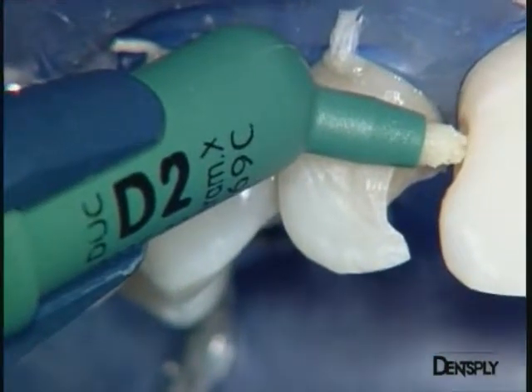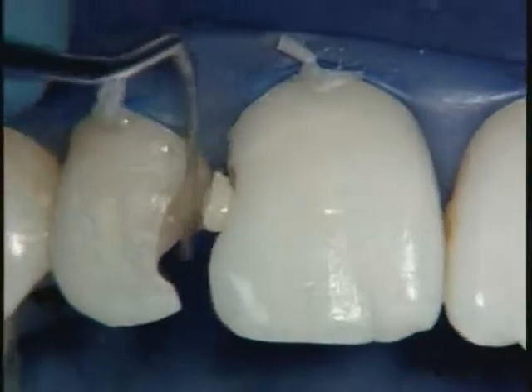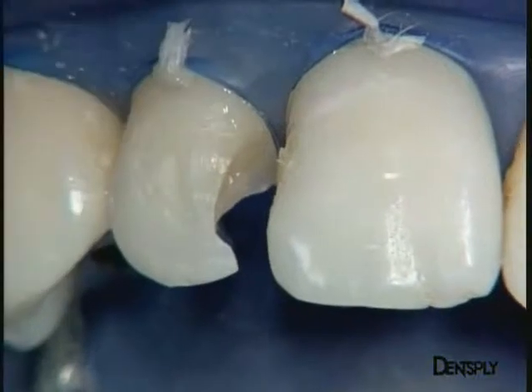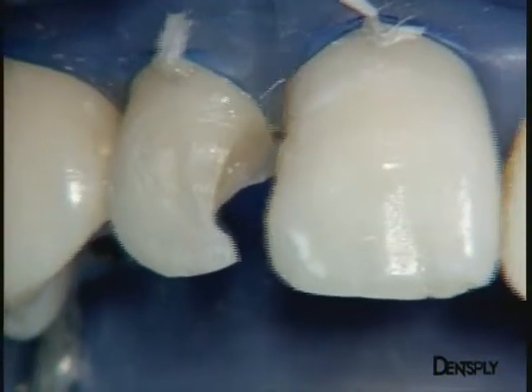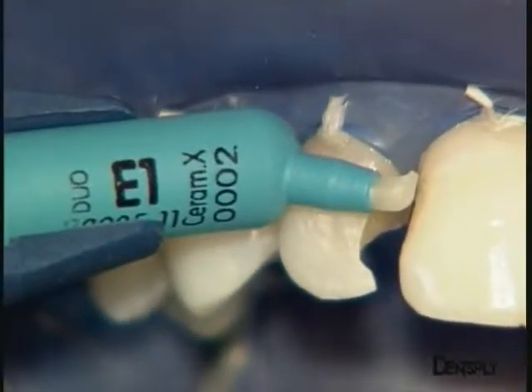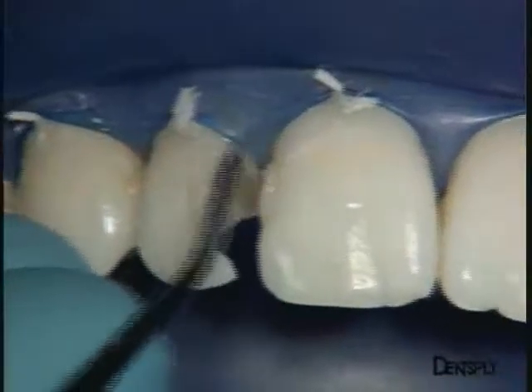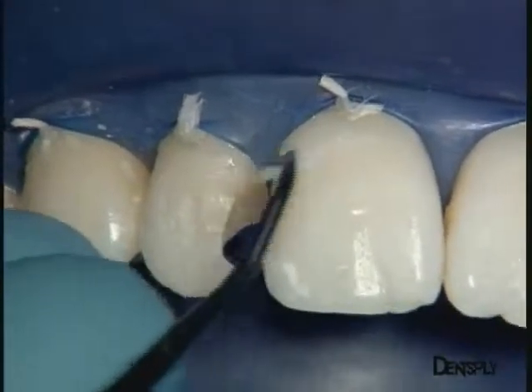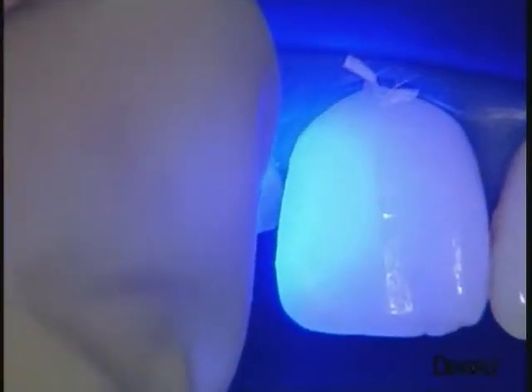We start with dentine replacement for the central incisor. Here the key is of no real interest, given that the lingual or palatal face of the tooth is still present. The Ceramix Duo is applied with a certain amount of pressure, and this dentine replacement layer is then polymerised. A little more Ceramix Duo is applied, leaving space for the enamel material, which is E1 for the central incisor. The material is applied — it does not stick to the spatula, making placement very easy — and this enamel layer is then polymerised. The stratification of the central incisor is now completed.